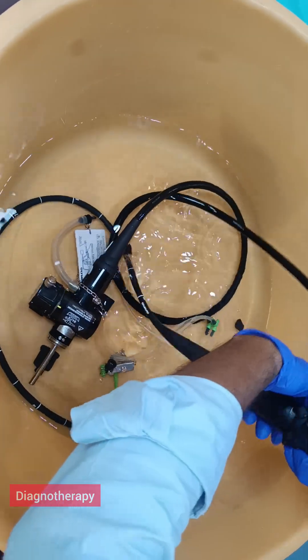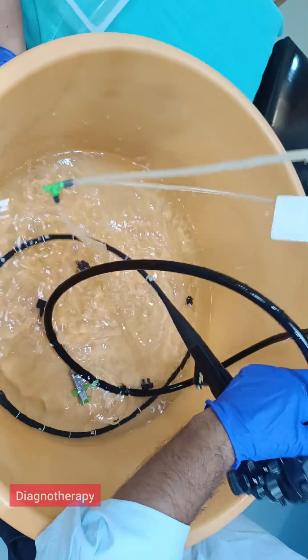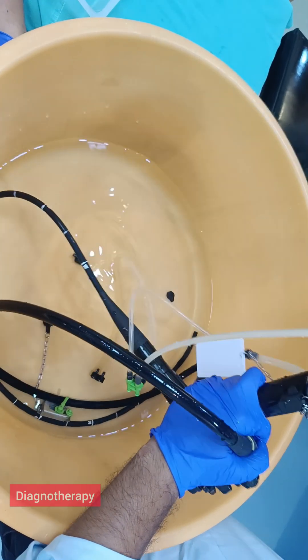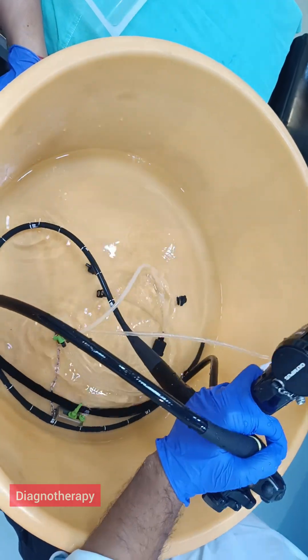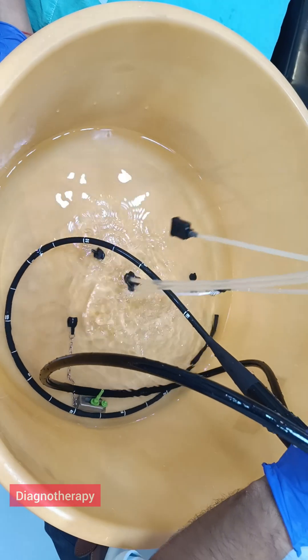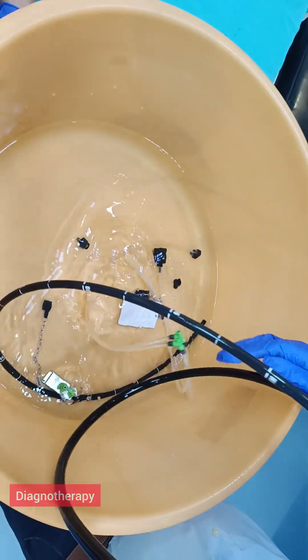After this is done we need to just remove this and take it out. This is how we flush the scope. Thank you!